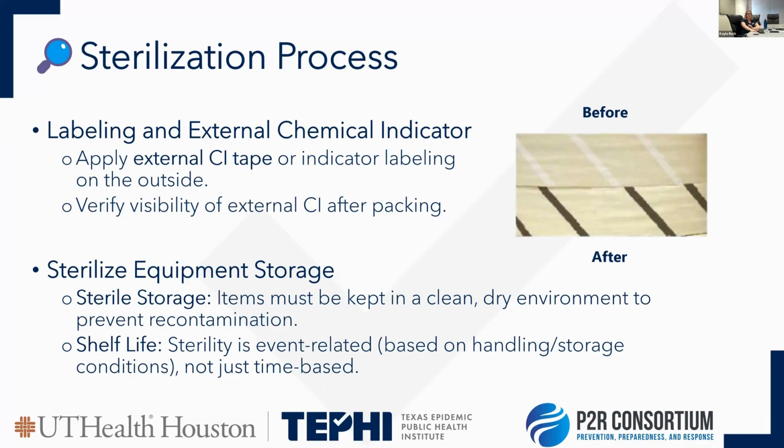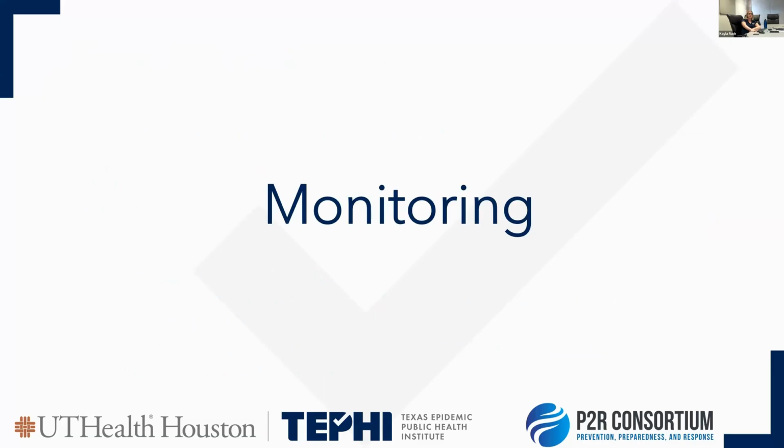looking at the different AAMI standards, and then your specific organization, if you're saying that, no, we want this recycled every X amount of times, or if it hasn't been used in this time, we want to re-sterilize it and reprocess it. Those are other things to be mindful of.